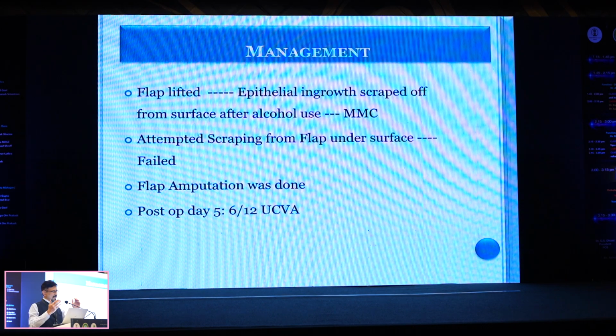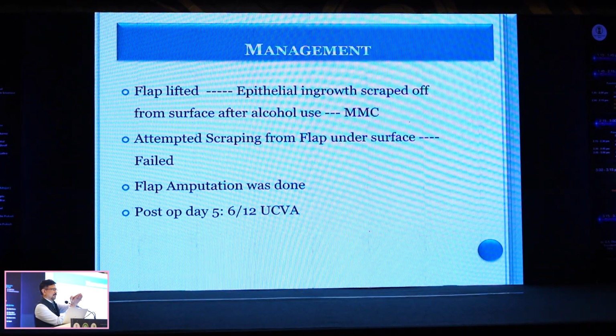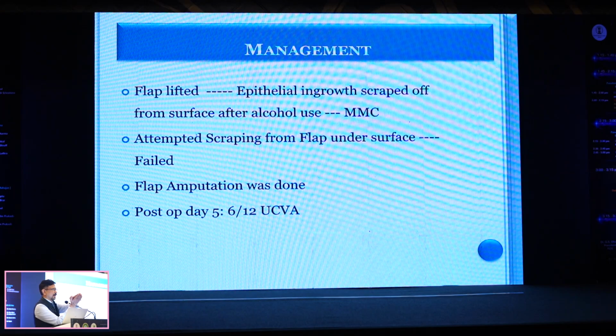Why? Because the thickness of the flap, it has been seen in different areas, is slightly different, microscopically different. And what happens is that the flap and the stromal bed act as lock and key. So when the flap is repositioned, that irregularity in the thickness of the flap created by the microkeratome is masked. But when you remove the flap completely, a little bit of irregularity is there, and that results in some degree of astigmatism.